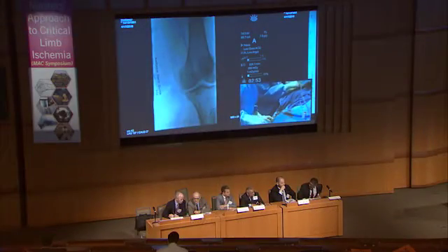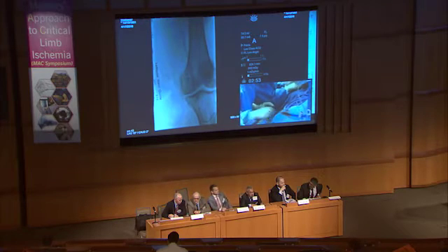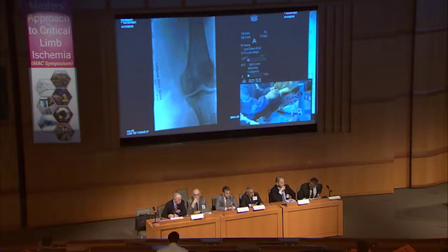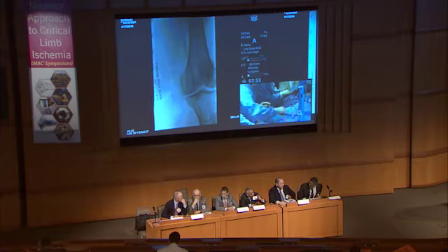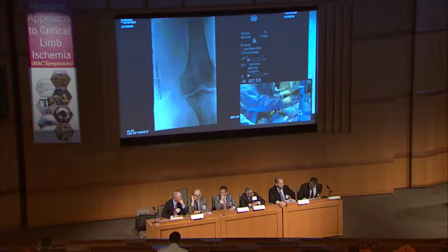So you would, in this case, go after some of the below-the-knee vessels? Yes, of course, it's mandatory because we can improve the inflow, but if there is no outflow, I don't think the clinical improvement could be helped in this way.